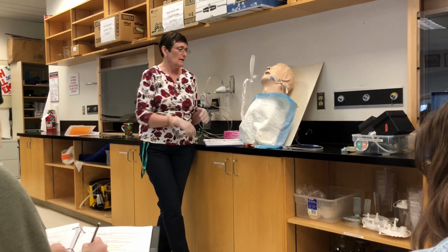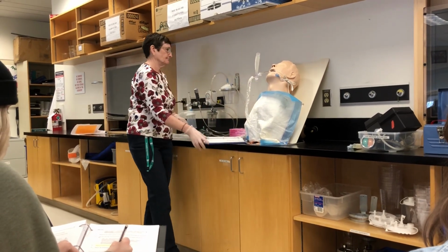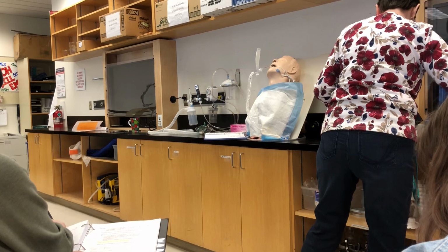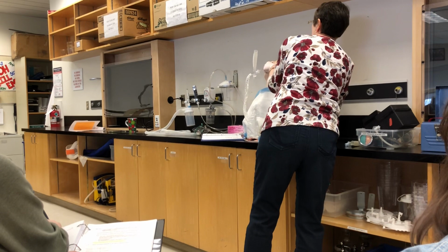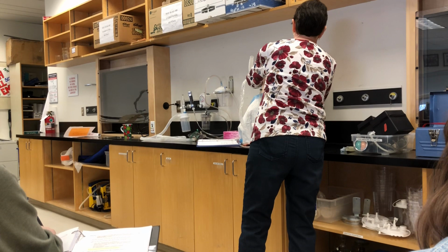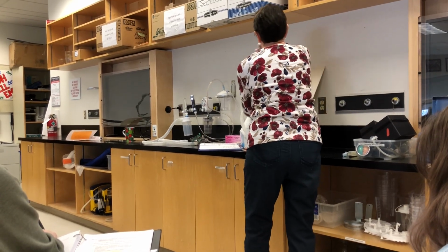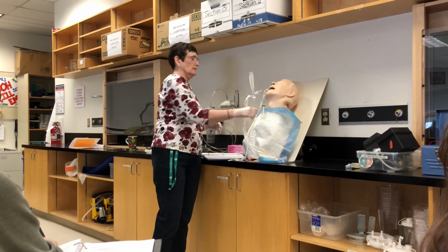Okay, all right. So I've got my yonker on. I am going to get a syringe. Oh, the box without a syringe. Okay, syringe, I'm going to attach it to his cuff. I'm going to disconnect all of my bow tie that's going on here. Oh my lord, look at all the knots. At this point, I really don't care whether I'm holding the tube or not.